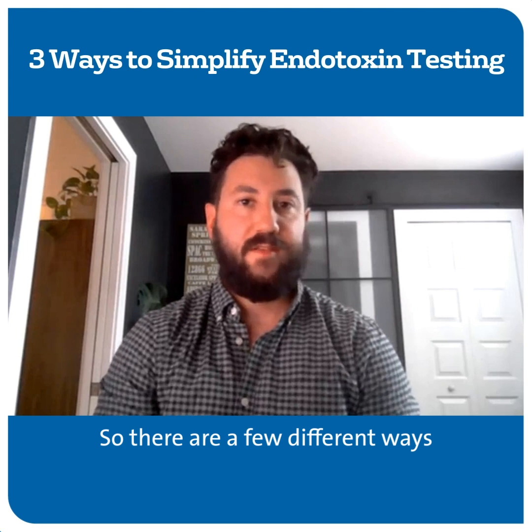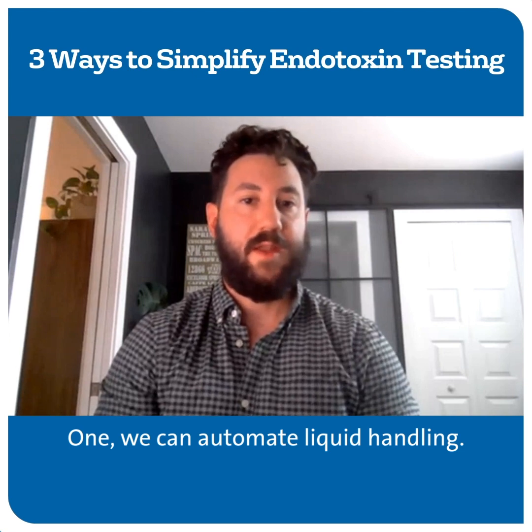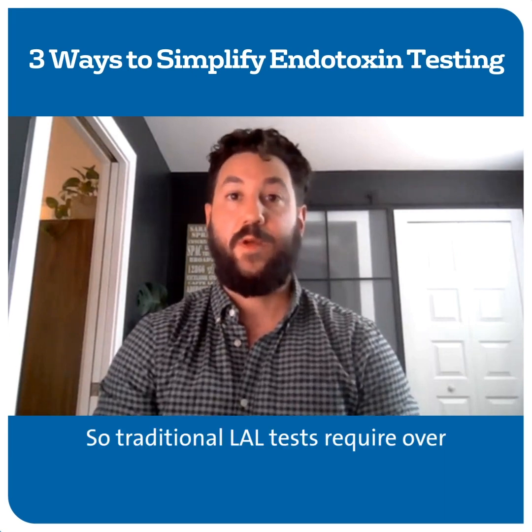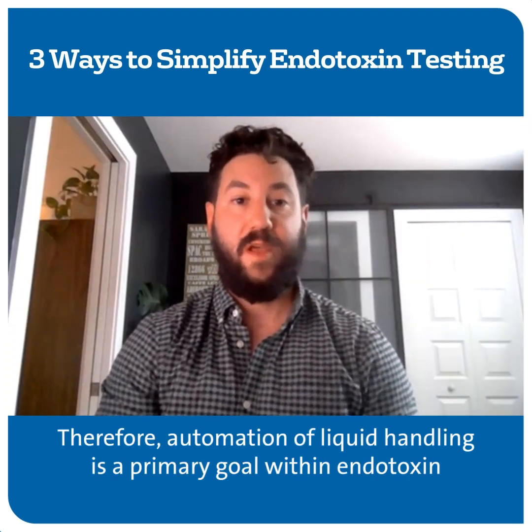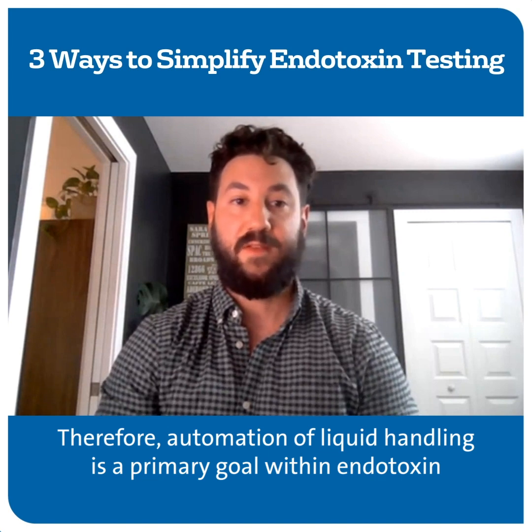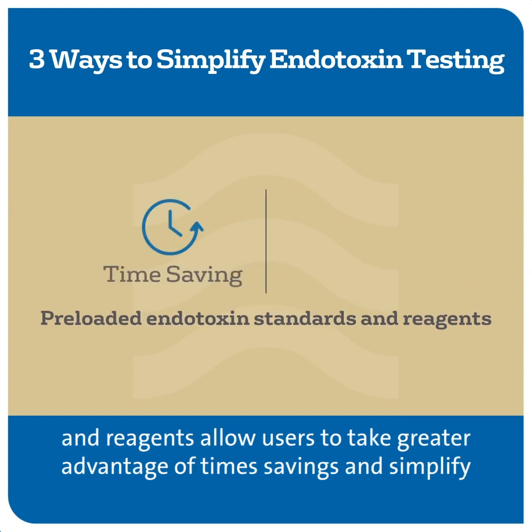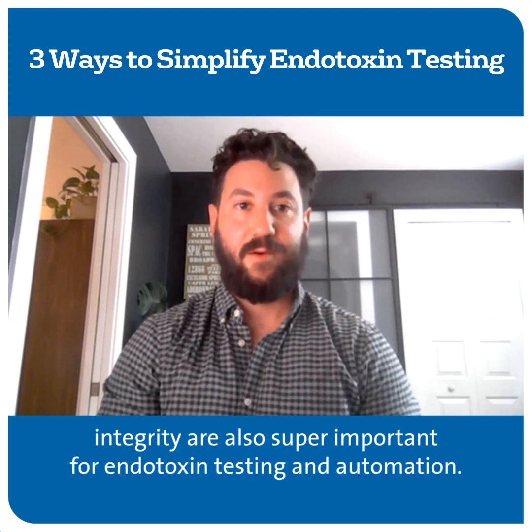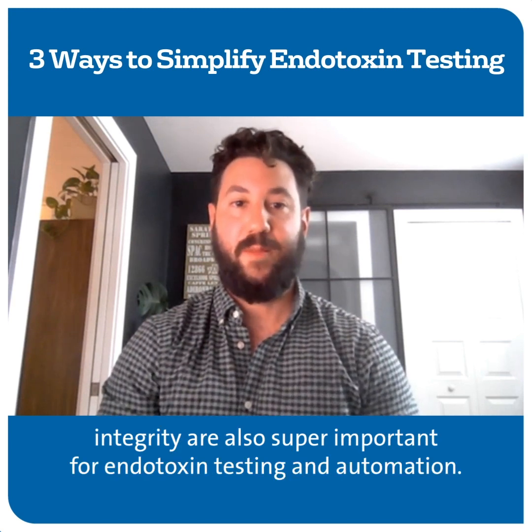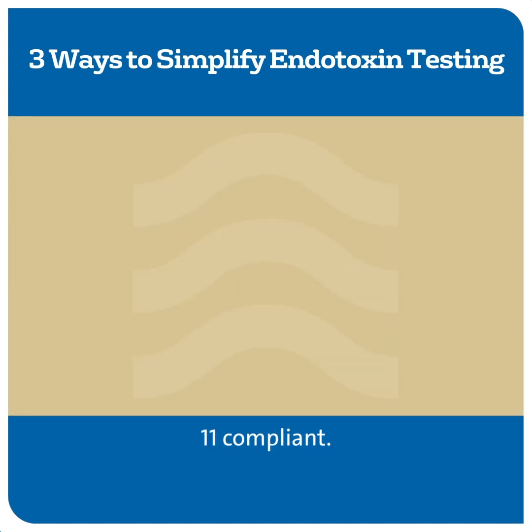There are a few different ways that we can automate endotoxin testing, and I'll go through a few of those. 1, we can automate liquid handling. Traditional LAL tests require over 200 pipetting steps for a full assay. Therefore, automation of liquid handling is a primary goal within endotoxin automation. Technologies that provide preloaded endotoxin standards and reagents allow users to take greater advantage of time savings and reduce that opportunity for error that we often see with traditional methods. Data management and data integrity are also super important for endotoxin testing and automation. We want to make sure all of our data and the data management is 21 CFR Part 11 compliant.